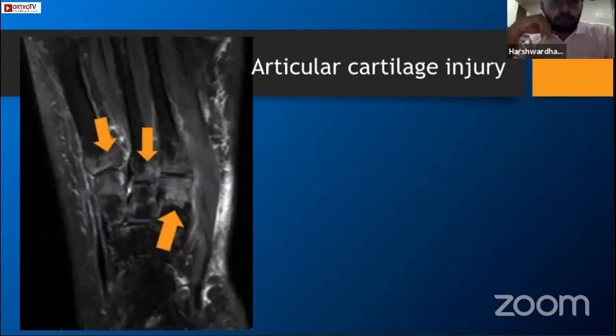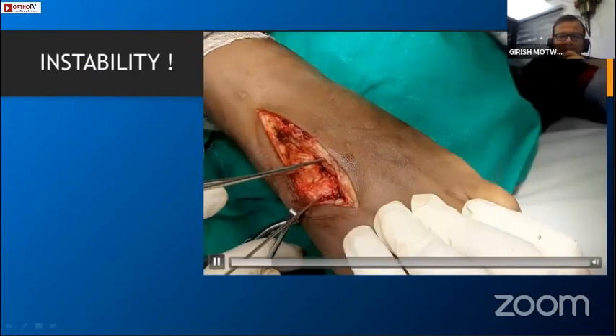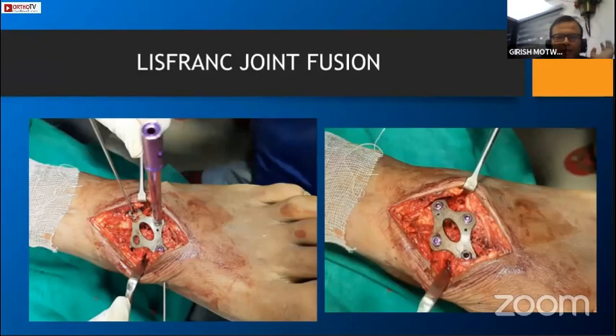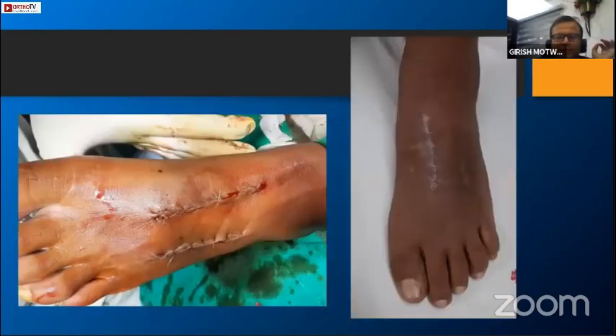Look at the cartilage injury - as Harsh has mentioned, there is a lot of cartilage tear and bone contusions. This was the instability when we opened the joint. Using small bone distractors - Hintermann distractors - and clamp application to get maximum possible stability of the medial column. I use a plate but I don't drill the base of the second metatarsal because I always feared making a new fracture if the position is not absolutely perfect.